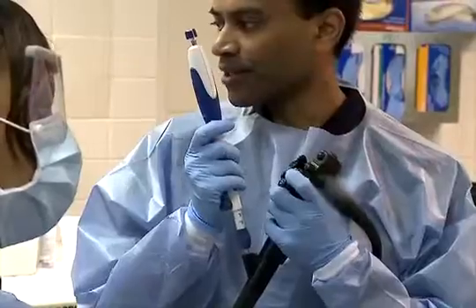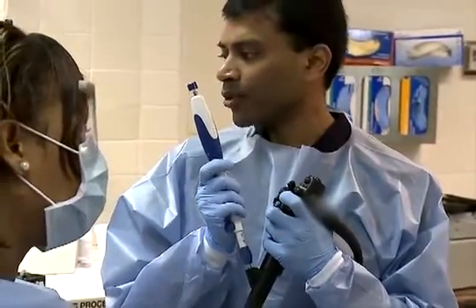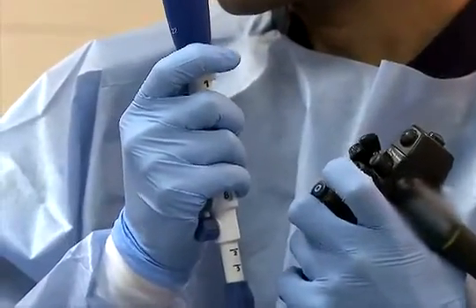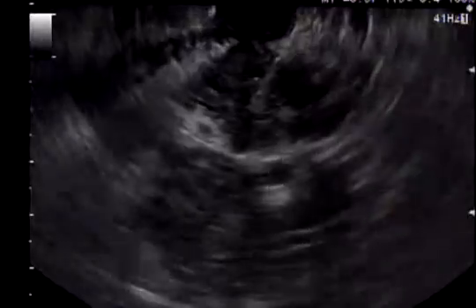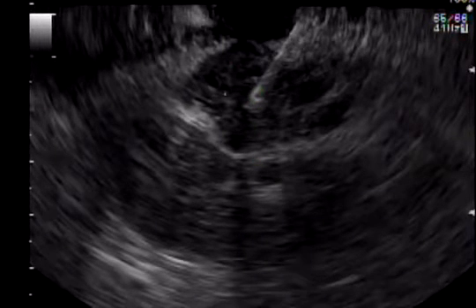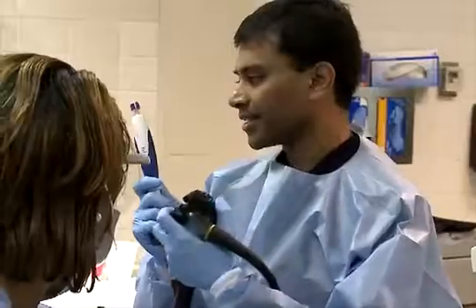Now with the mass in position and the needle out of my sheath, I'm going to use my elevator a little bit to get the lesion exactly in position I want it, and I'm going to advance my needle into this mass. It's going to be a quick jabbing movement, and as you can see, the needle is already inside the lesion. Here is the tip of the needle, which is very echogenic, and here again is the mass. An important part of the EUS FNA needle assembly is the ability to visualize the needle within the mass at all times. Now since the needle is inside the lesion, I am now going to remove the stylet.